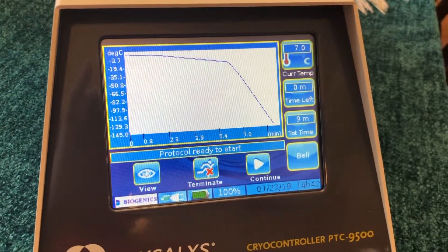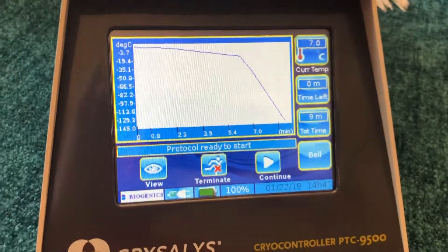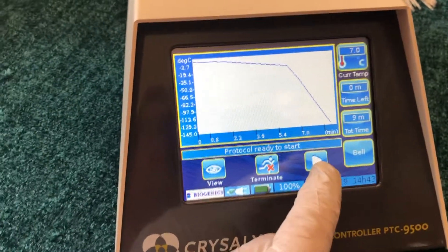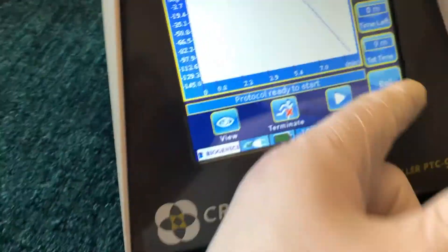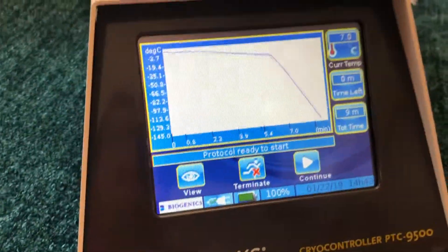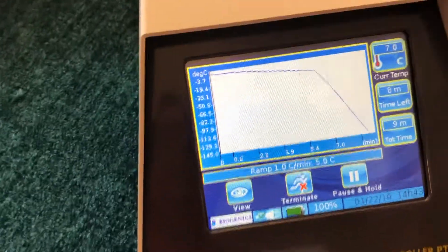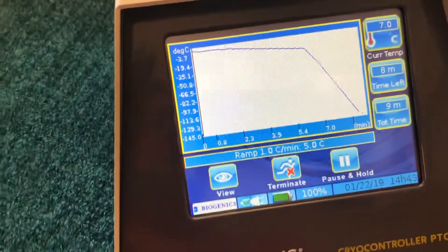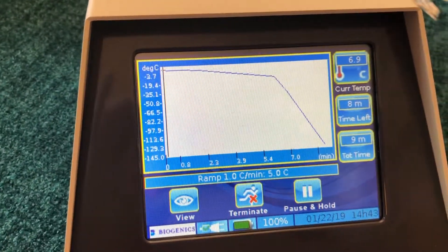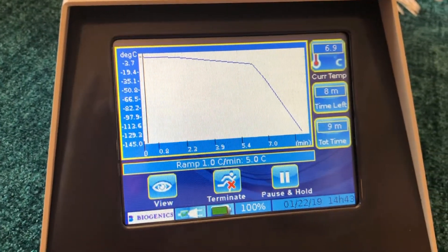We have reached start temperature. Remember that safety feature? Now you can see the Continue button showing up. First we silence the bell — which sounds at the beginning of the program to let you know she's ready to go — then we push Continue. Now there's a status bar which walks from left to right across the screen. When we get to minus 12 at the knee of the curve, that's when the action is really going to begin.